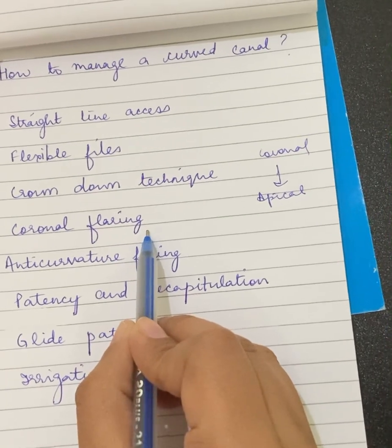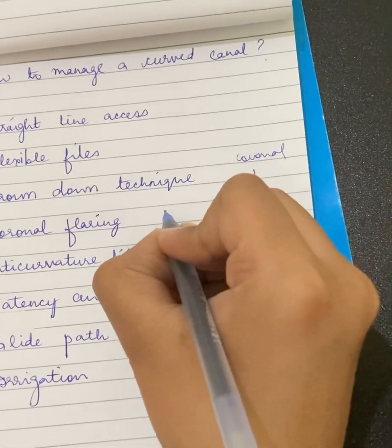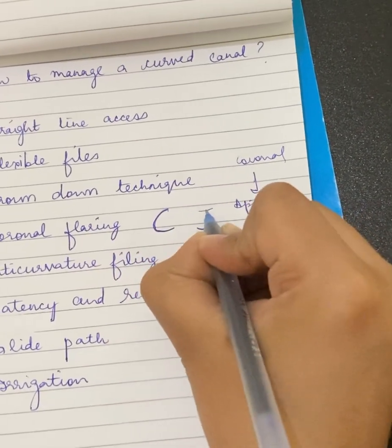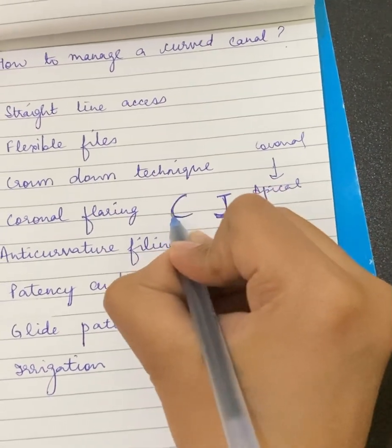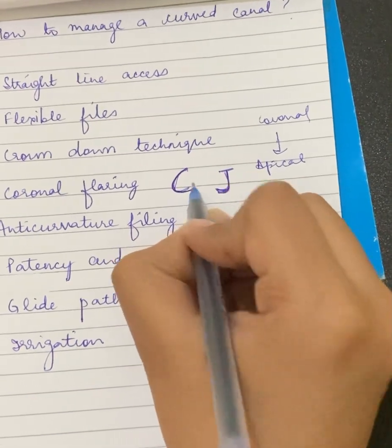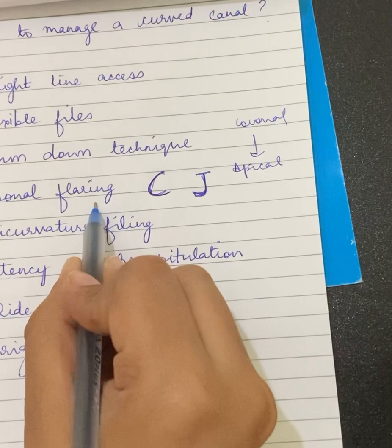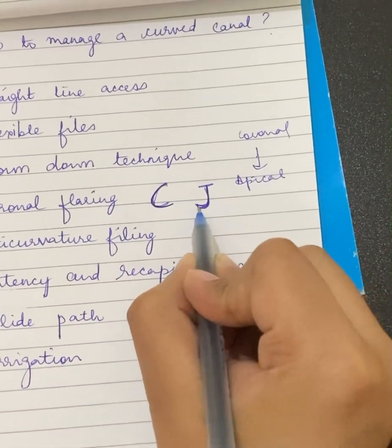structure is not destroyed. Also, coronal flaring helps in changing this C-shaped curve into a J-shaped curve. This J is very easy to negotiate, whereas a C is a double curvature which will be difficult to negotiate later. So always go in for coronal flaring. That will remove any kind of dentinal obstructions and make your path smooth for the files to enter.